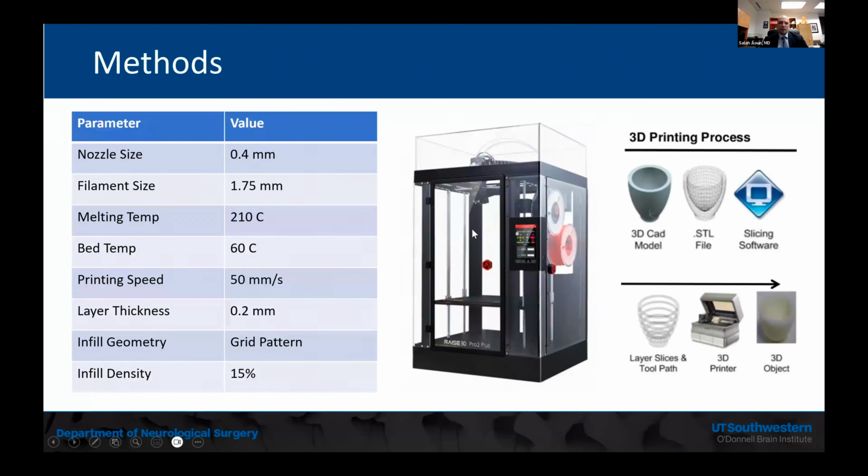This is one of the 3D printers that we use. It's made by Raise3D. They make industrial printers. It's a dual extruder printer, meaning it can print two materials at the same time, and I'll let you know why this is important. This printer is capable of printing an entire spine. So it'll print it from C2 all the way to the pelvis. So it makes it much more practical than reassembling a model from smaller parts.